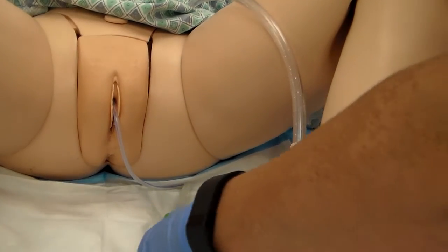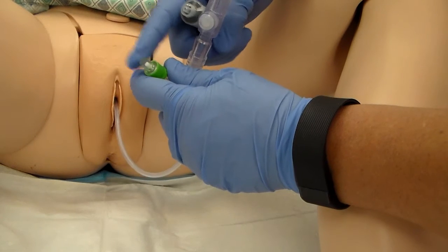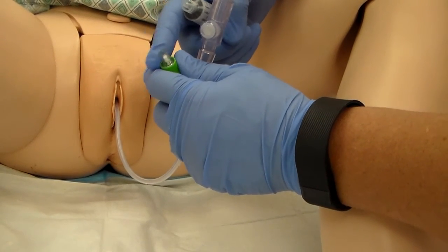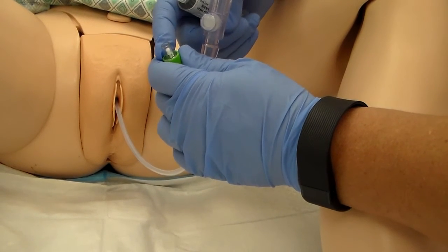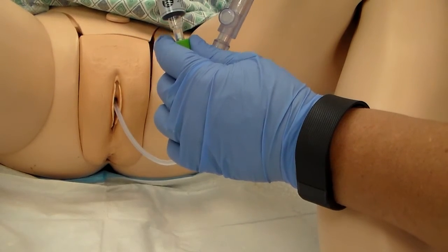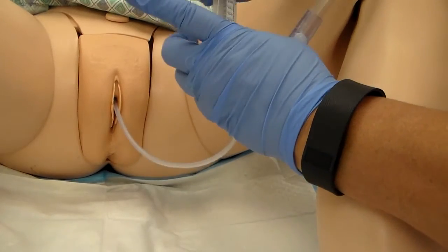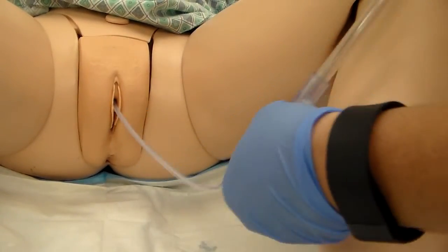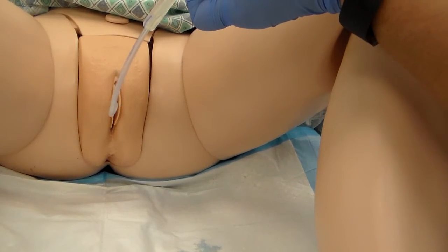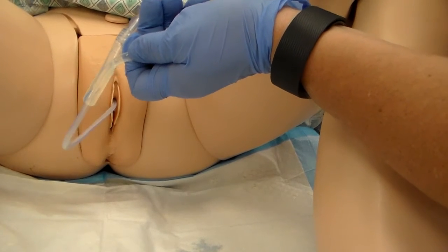All right. So then what you want to do is, this is the not airport, but fluid port. This is where you're going to put the 10 milliliter syringe in order to withdraw the normal saline from the balloon, okay? And I say 10 milliliters because that's normally what goes in, okay? So we're going to withdraw 10 milliliters of normal saline.